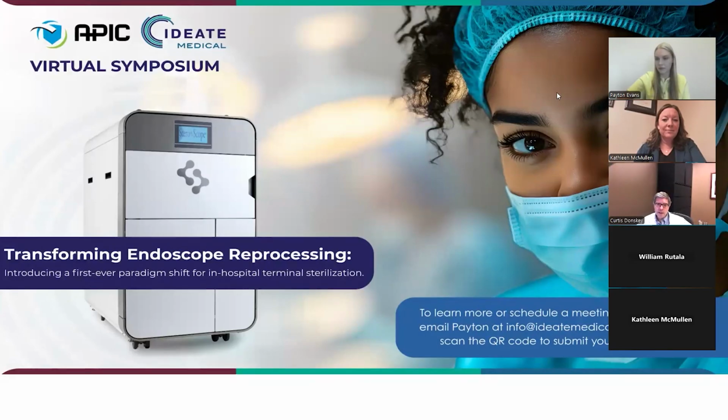So we have not done an extended evaluation, but we used one scope for the testing that we did. We ran the scope probably 25 or 30 times, I'm guessing, and did not see any damage to the endoscope. I think more information is needed, but at least in our limited evaluation, we didn't see any damage.